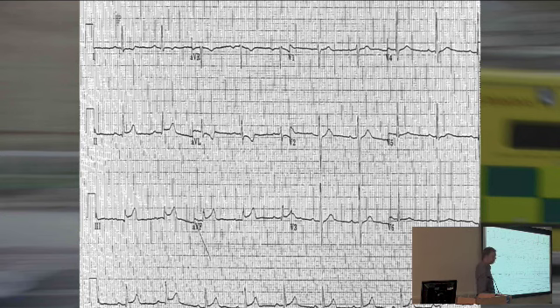This is an inferior MI, the ST elevation in 2, 3 and aVF of the inferior leads. And you've got reciprocal ST depression again in aVL. If you see that reciprocal ST depression, it makes it much more likely that it's an MI that you're seeing.